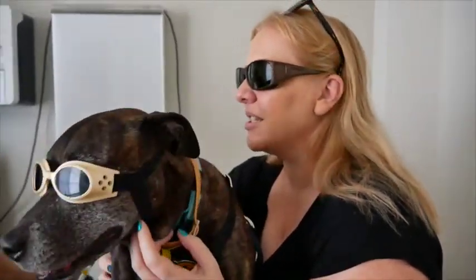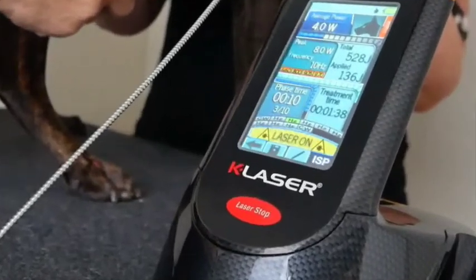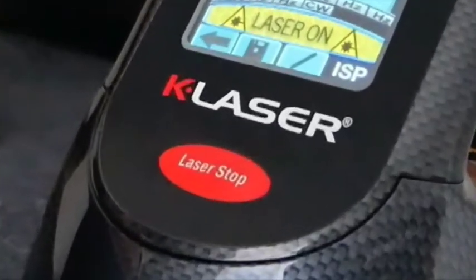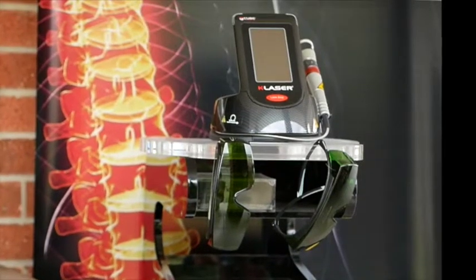The most amazing case is one of our ear cases, actually. This particular dog had problems with his ears for years, and when we examined the dog, you could not get the scope down the ears. We admitted the dog, we did culture sensitivity, we did a general anaesthetic ear clean using our video otoscope and such. Did we put it on medications?